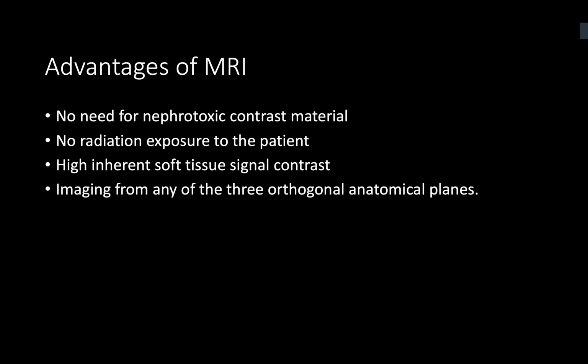We can use it only for some special occasions where the patient already had biopsy previously, or if there is any previous history of prostatitis. So in confusing clinical scenarios, we can use the utility of dynamic contrast enhancement. But it is possible to get a PIRADS score with just the parameters T2 and the diffusion weighted image. Diffusion weighted images, yeah.